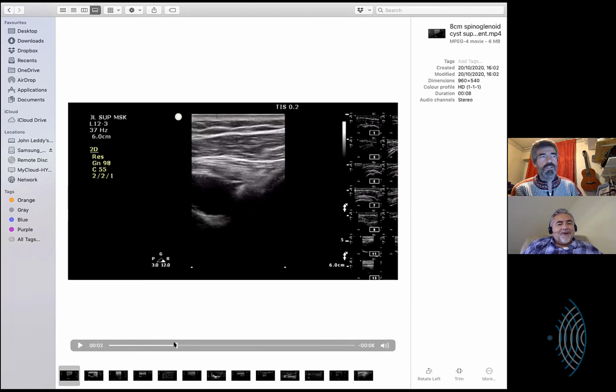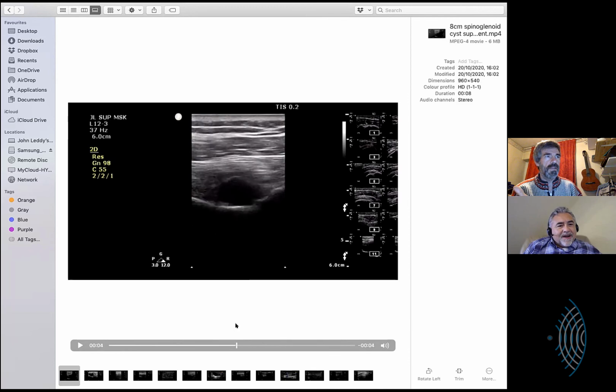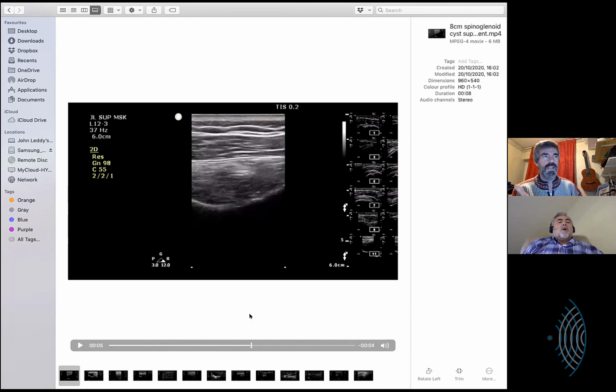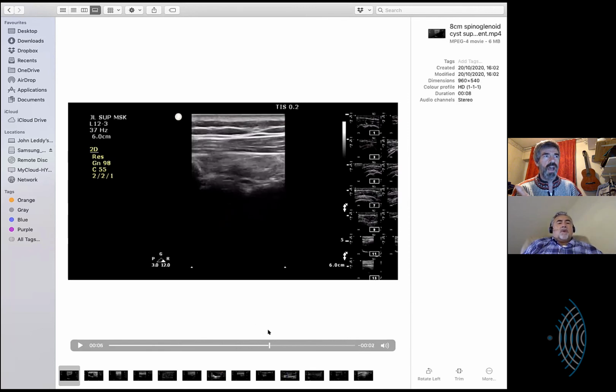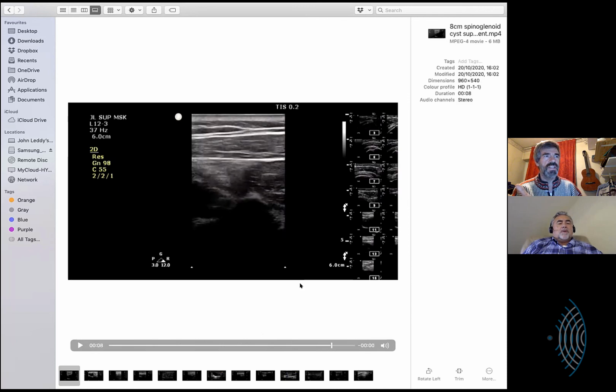But the point of showing you this is not that. It's as I go through it, and I'm going to come up through here. Wait a second. So this is the infraspinatus fossa, yeah? Yes. Yeah, look at the quality of the muscle. It's not really, and I'm going to go a little bit further through. And do you see this muscle just at the side? Yes. That's teres minor. You see the texture?